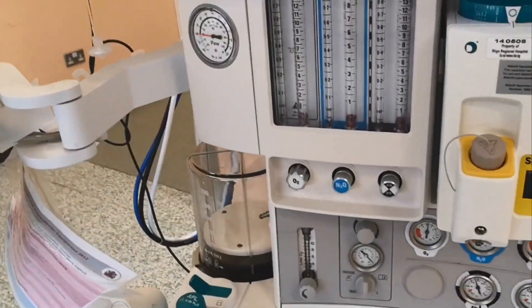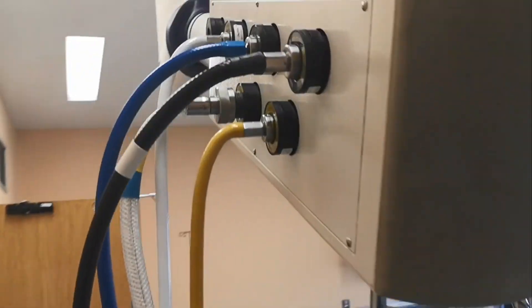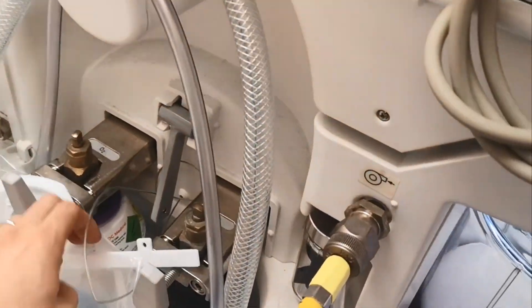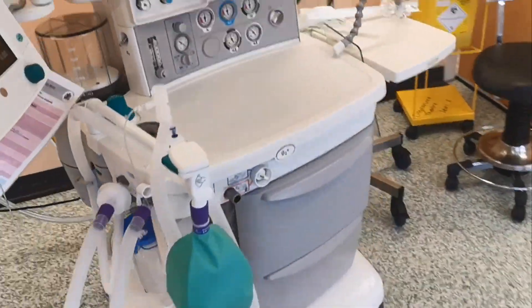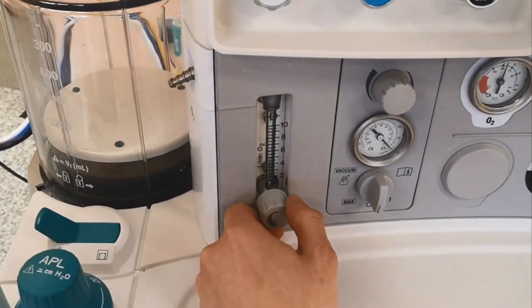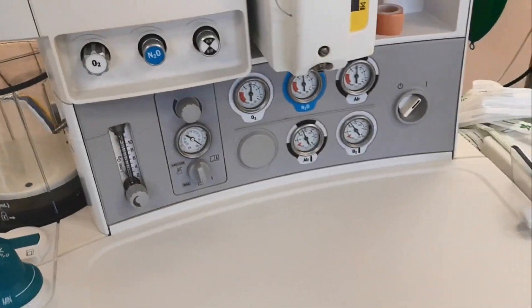As usual, we have the cables — air, oxygen, vacuum, and scavenger going into the ventilator here. We have the oxygen backup. Then we have our usual components: anesthetic gas, external oxygen, vacuum, and the vacuum chamber down here.